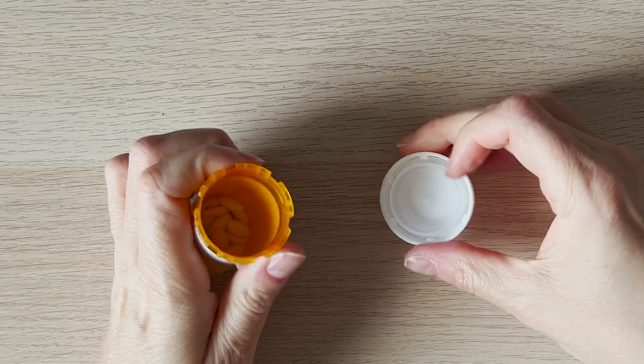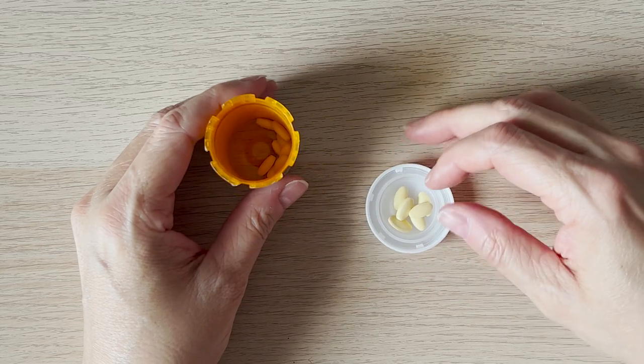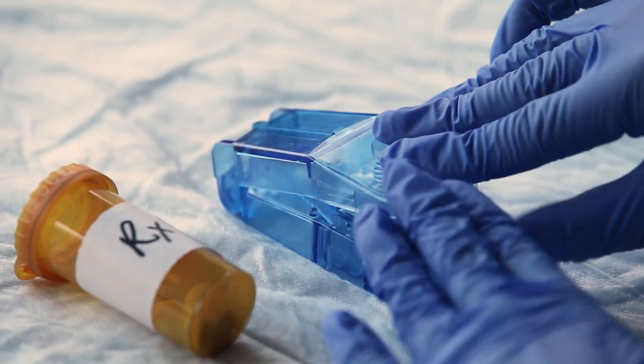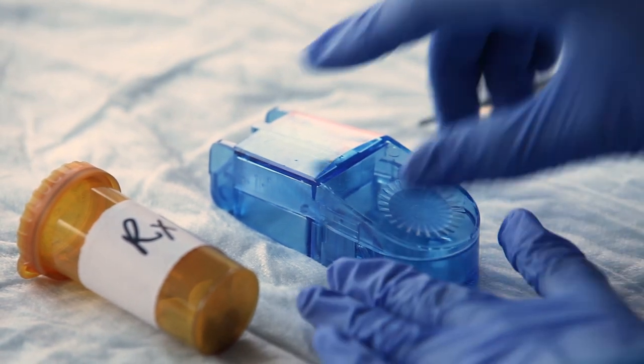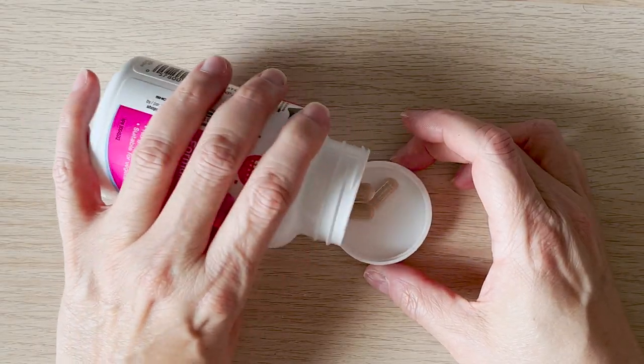Many medications taken by mouth come in either liquid or pill form. If a child has been prescribed pills but cannot swallow them, they can sometimes be split in half or crushed to make them easier to swallow. But some medications only come in capsule form.